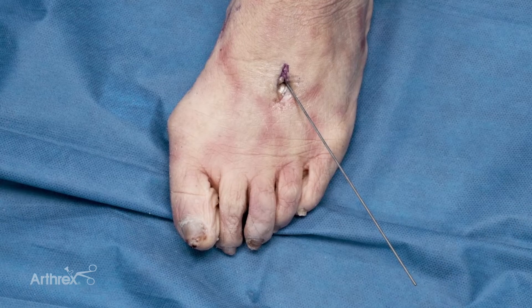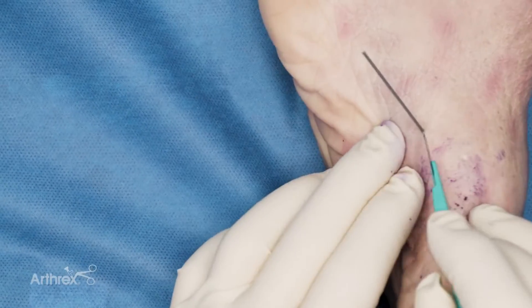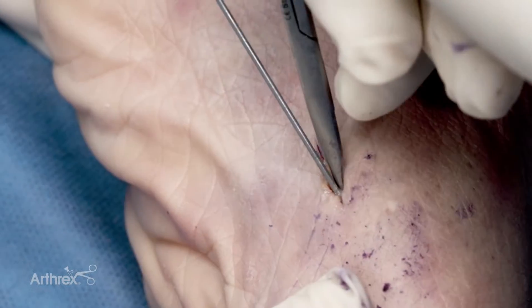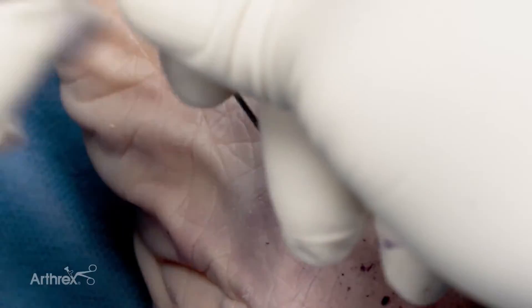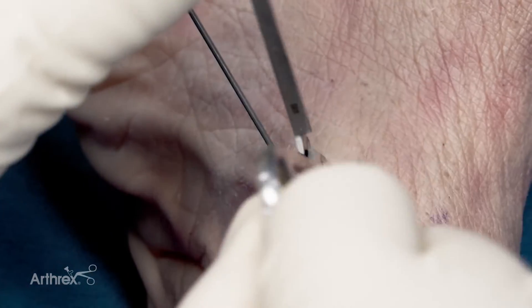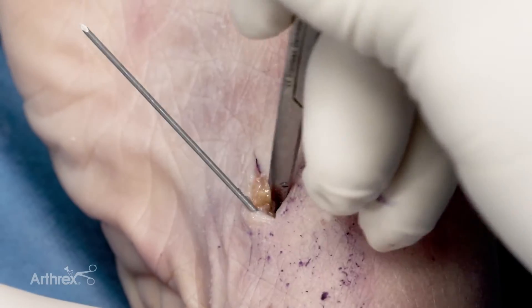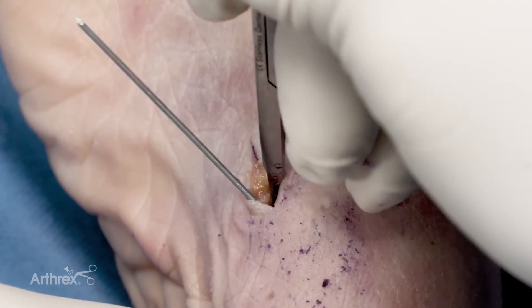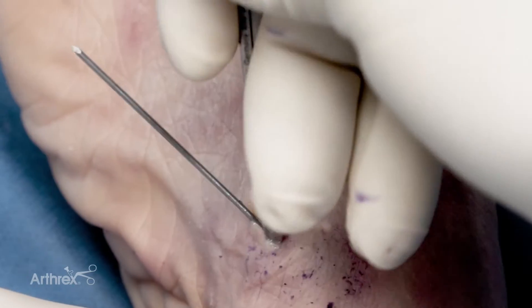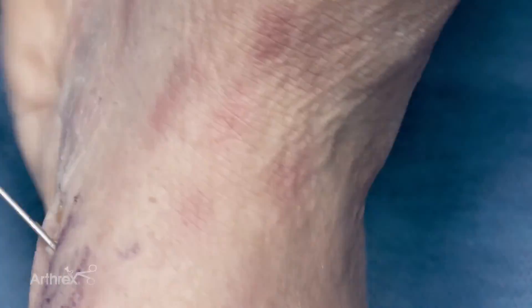Once I'm happy with that, I'm going to make an incision over my pin on the medial side to place my tightrope. Once I'm convinced I'm against bone, I'm going to spread my scissors to make sure there's no soft tissue around the area. Sometimes I'll even spin my scissors all the way around the pin to convince myself that I'm not going to catch the tibialis anterior. Then it becomes very simple for the reduction technique.